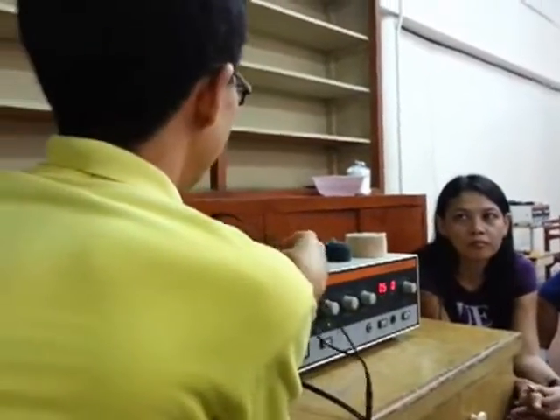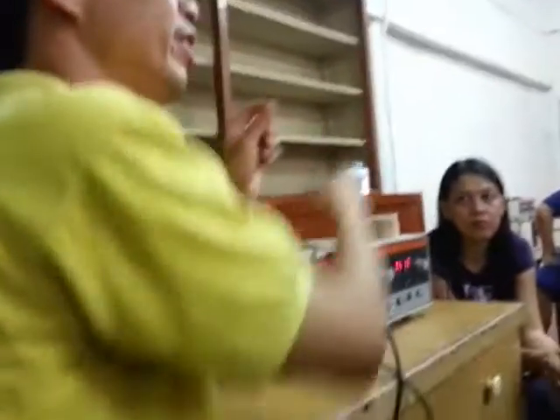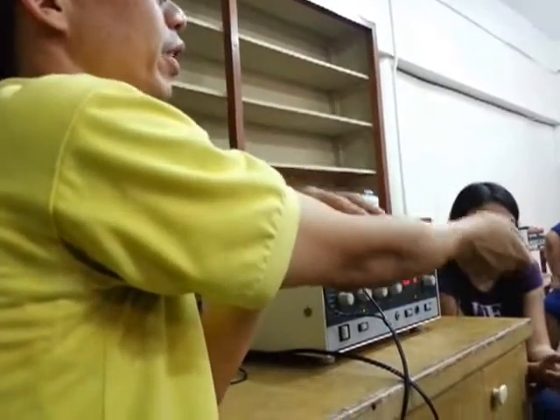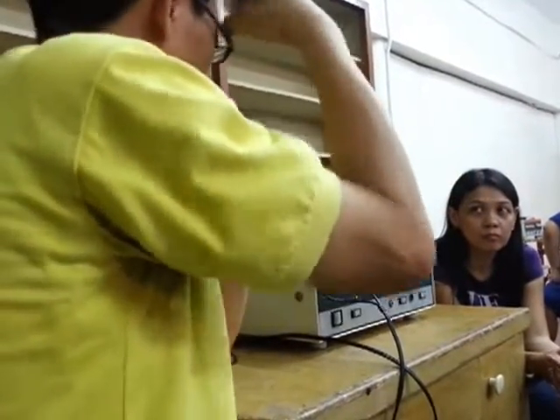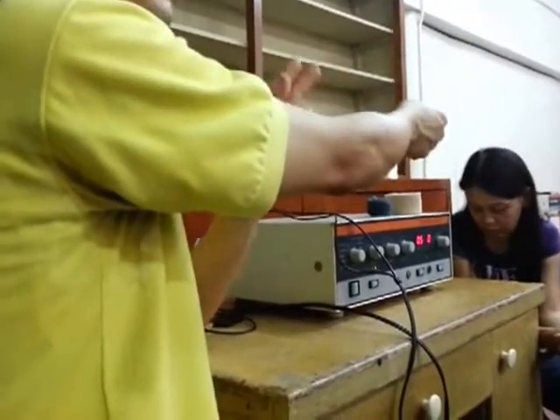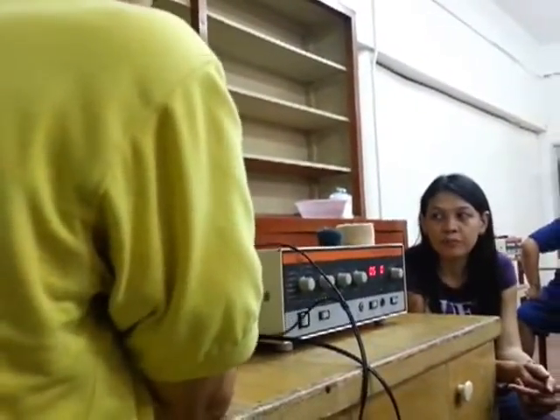Usually, the motor point or nerve trunk is found more approximately at the center of the muscle belly. So you're going to apply the cathode there in that area, then the anode would just be applied proximally.